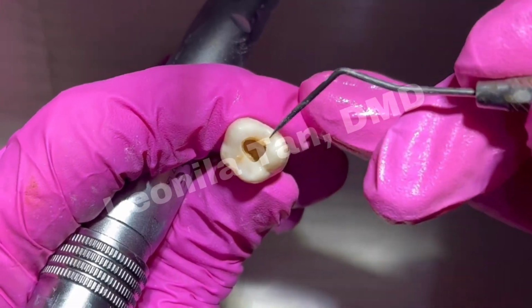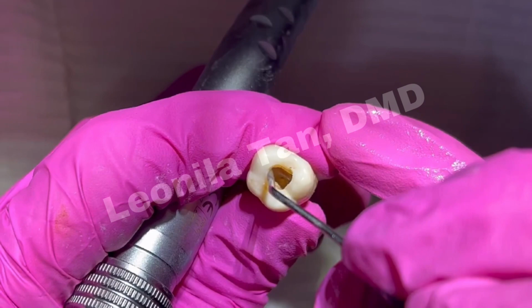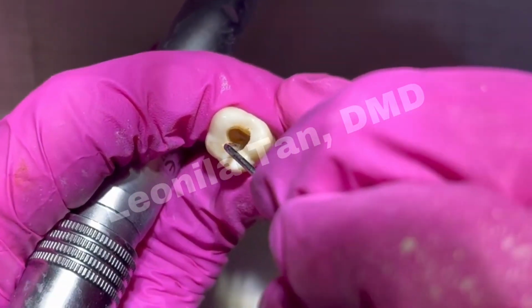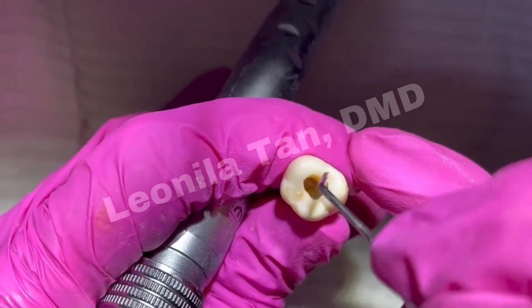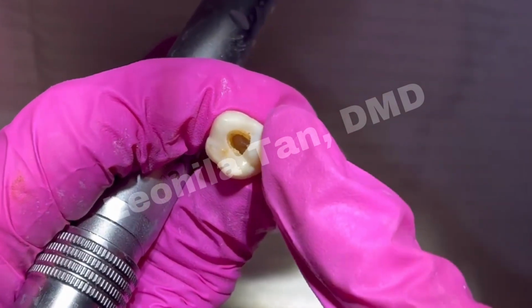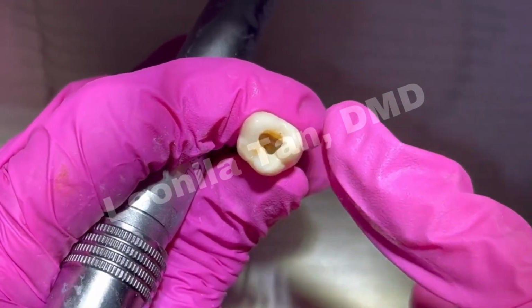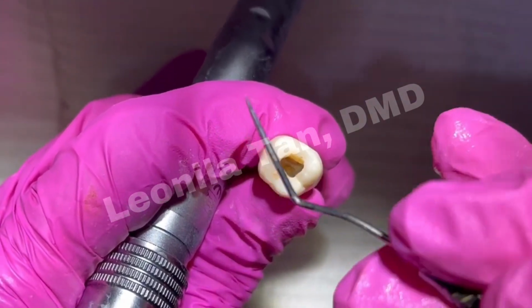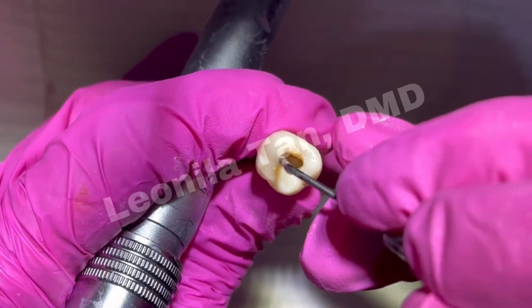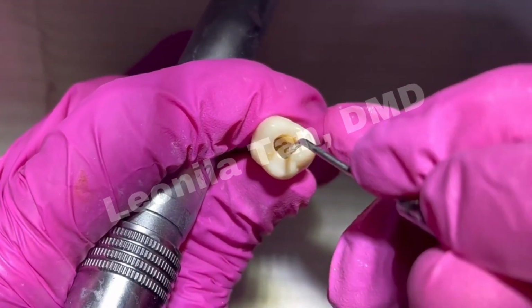So you have a very conservative way of diverging your walls, just enough for you to directly see your orifices. So on the patient, you have to be able to see their orifices directly without having to move or adjust your head to see the orifices. You should be having a straight look into the orifices.